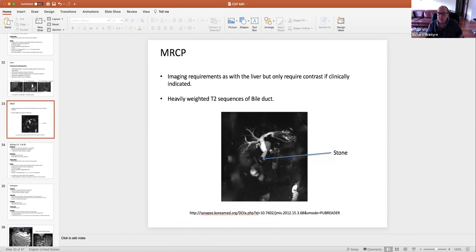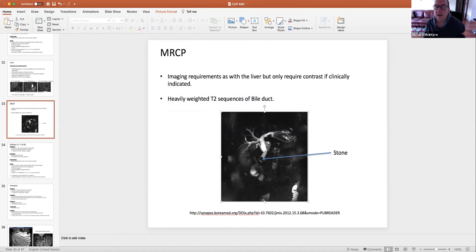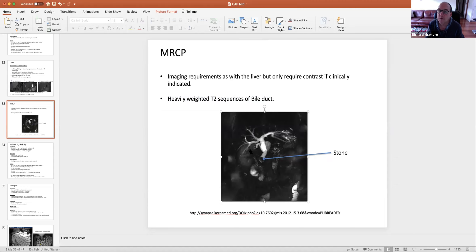MRCP is like an ERCP or CT cholangiogram — it's a heavily T2-weighted image of the bile ducts. T2 weighting relies primarily on TE; a longer TE means stronger T2 weighting. A standard scan uses a TE of about 100, but an MRCP image would be acquired with about 700-800. The bile is very, very bright; the background is very dark because it has dephased. You can see dilated bile ducts and a stone in the bile duct blocking the flow.